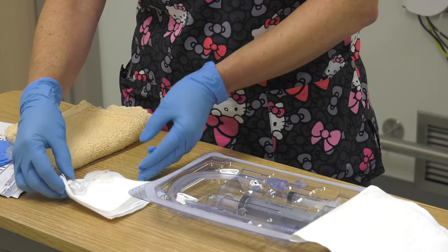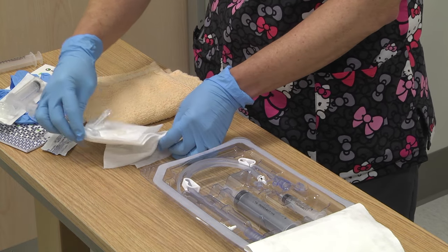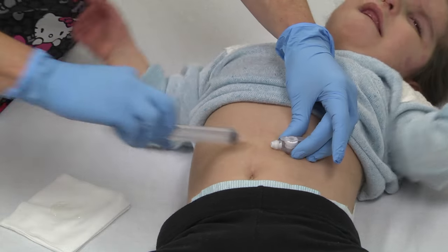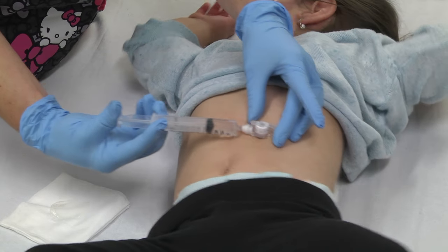Lubricate the tip of the G-tube and set it down on a clean cloth — it is ready for insertion. Have the child lying on his back.